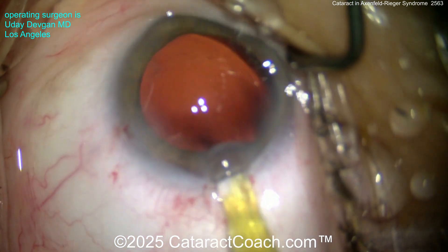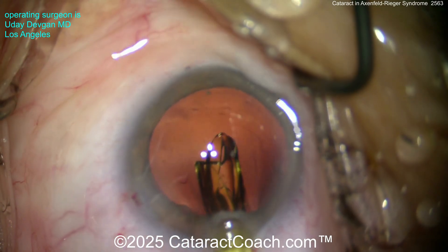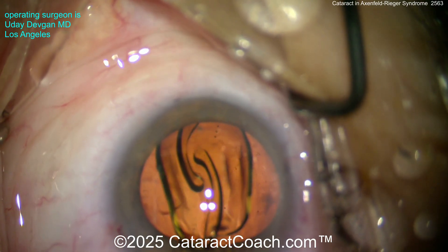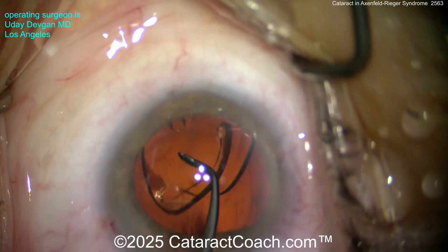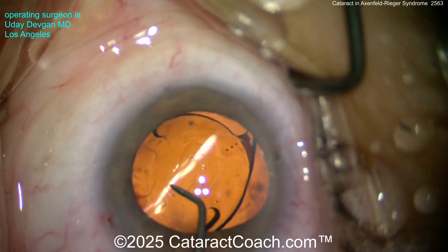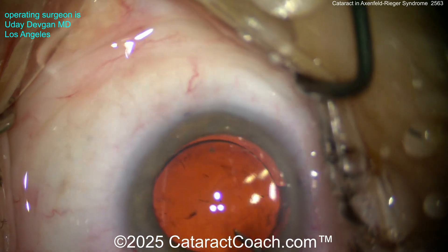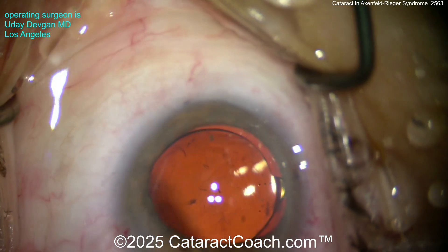I like the instrument to be perfect. Here comes the lens — a single-piece monofocal acrylic toric lens. We're going to get that slowly delivered into the capsular bag. The cornea already has marks at around 90 degrees, and that's where we're going to line it up — aligning the toric marks of the IOL with the marks previously placed on the cornea. There are obviously many different ways of lining up a toric lens.